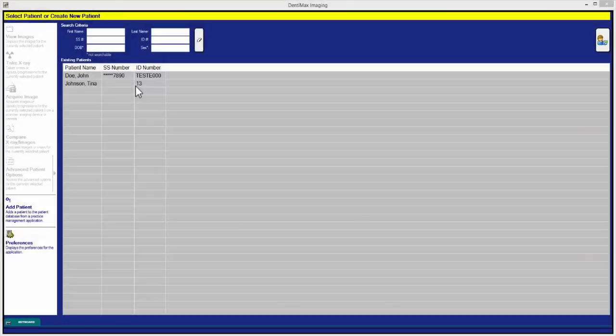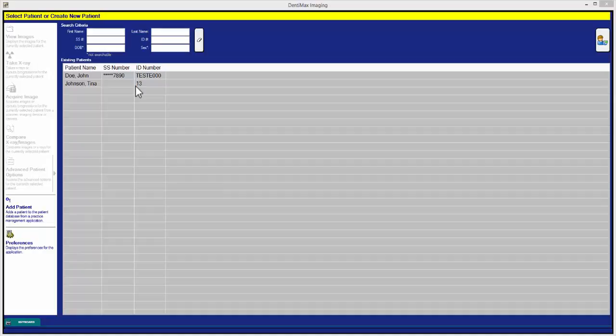Today we're going to cover how to use the compare x-ray images tool in the Dentimax imaging software. To do so you must first select your patient.